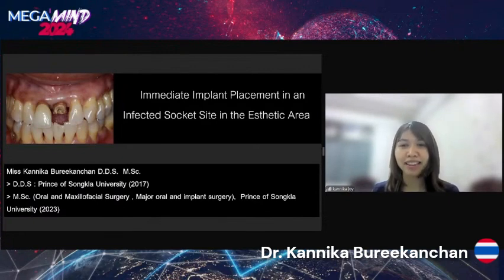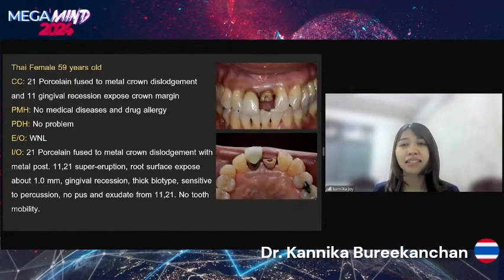My name is Miss Kannika Bureekanchan, graduated from Prince of Songkhla University, Thailand. Today, I will present an immediate implant placement in an infected socket site in the aesthetic area. Let's get started. Thai female patient, 59 years old.